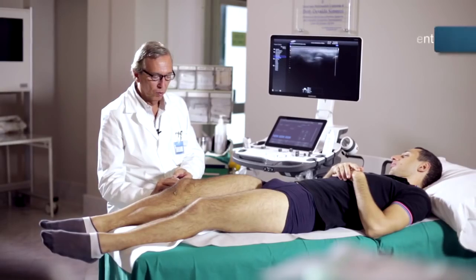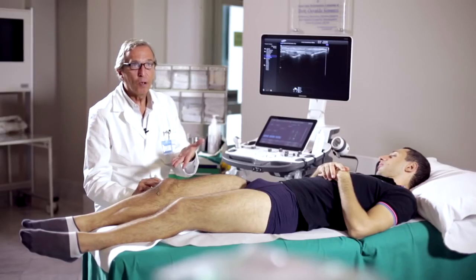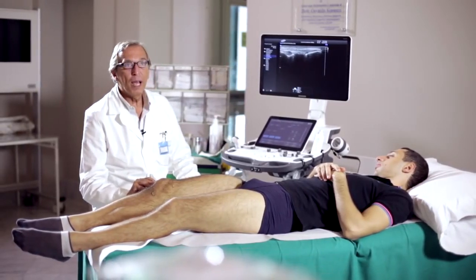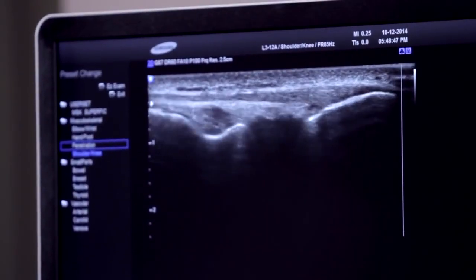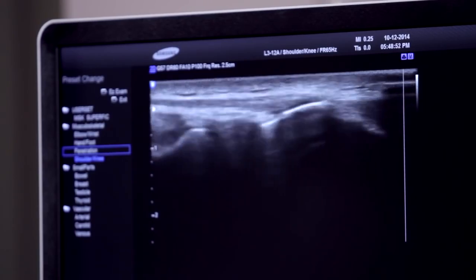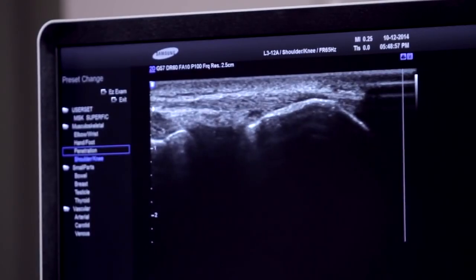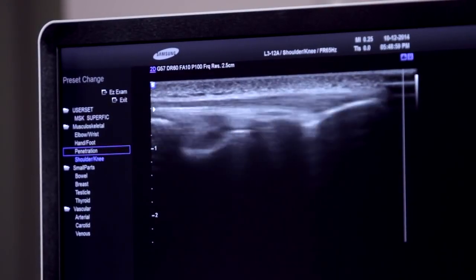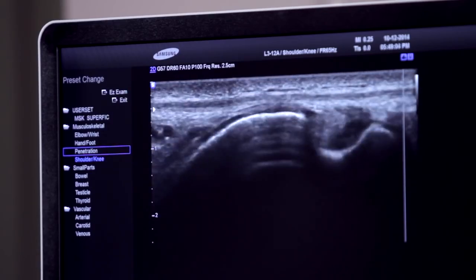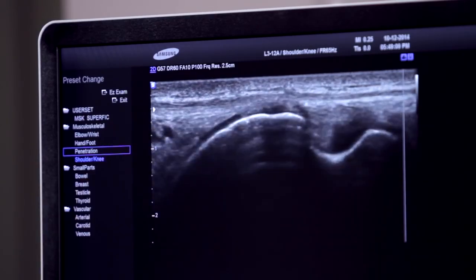We move on to the lateral component of the knee to study, first of all, an important structure, located more anteriorly with respect to the ligament components. This is the iliotibial band and originates from the fascia lata tensor. You can see it on its long axis length, and we can highlight the insertion of its component at Gerdy's tubercle. The iliotibial band, if examined proximally, has close ties of contiguity with the lateral femoral condyle, which, at this level, is often the site of friction.